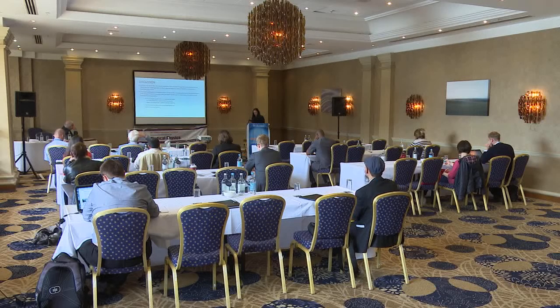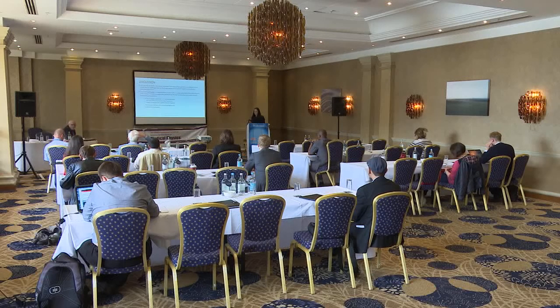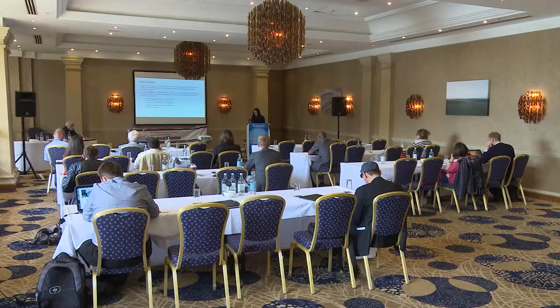And the discussion. The study presents the results of patient radiation doses in ERCP collected from a single center and describes the method of establishing and reviewing local diagnostic reference levels as a practical tool for dose optimization and for quality assurance management. Setting up local DRLs for dose-intensive fluoroscopically guided procedures, such as ERCP, was a challenge due to the large variation of patient radiation doses and fluoroscopy times.